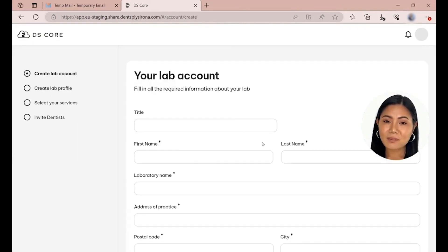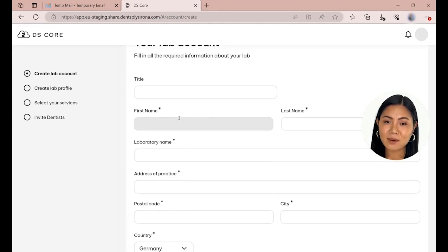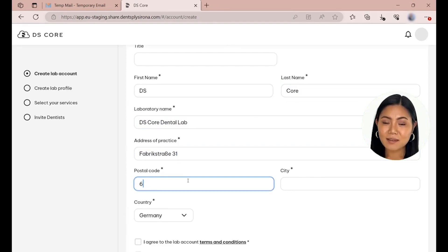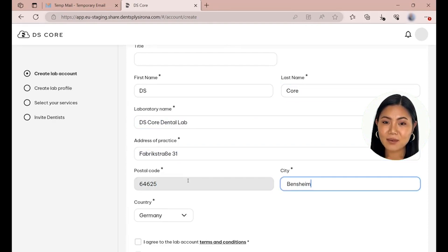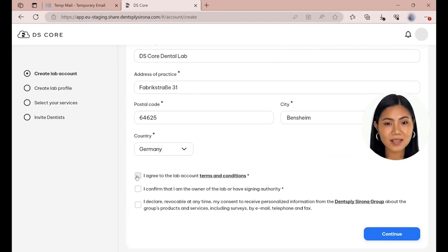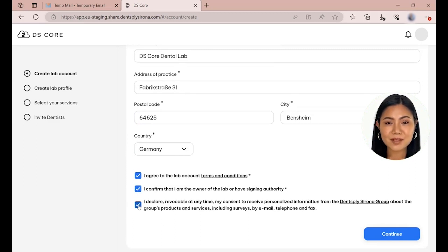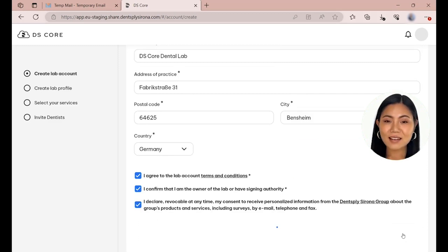In this step you need to provide basic information about your laboratory. Fill out the name of the owner, the laboratory name, and your address. Confirm the terms and conditions for the use of DSCore as a laboratory, as well as that the user is the owner or has signature authority. Optionally you can declare your consent to receive personalized information from Dentsply Sirona about products and services. Now click on Continue.